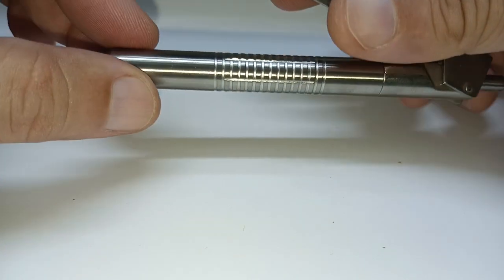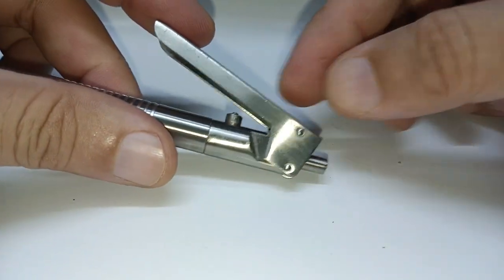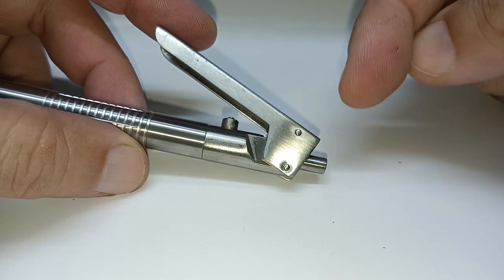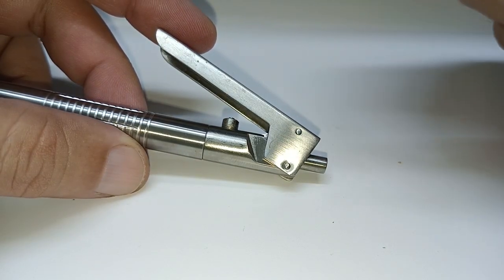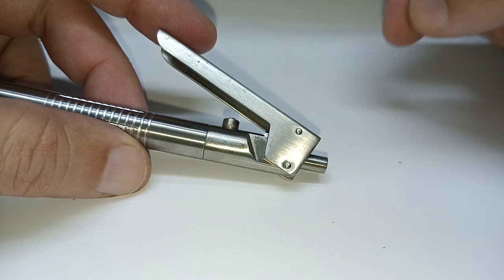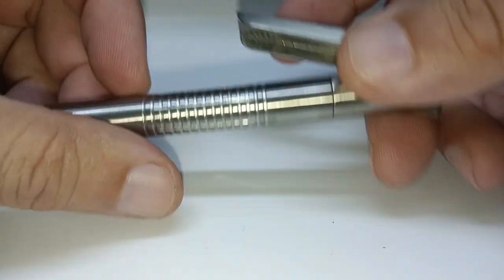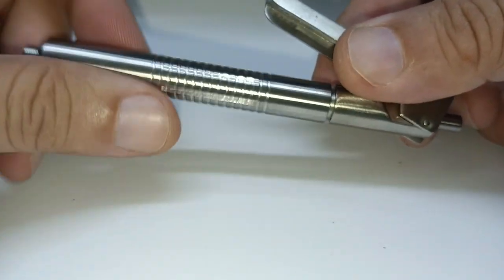Once you're done injecting, the tooth should be numb all around. Normally what I've noticed is all you need to do is maybe give one or two clicks on every tooth surface. On the mesial facial you give one click, on mid-facial you give the second click, on distal facial you give the third click. You can do the same thing on the lingual three points.